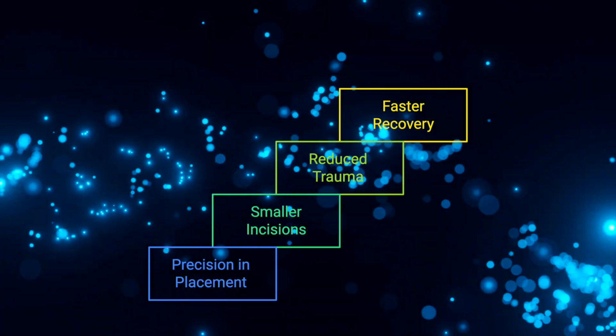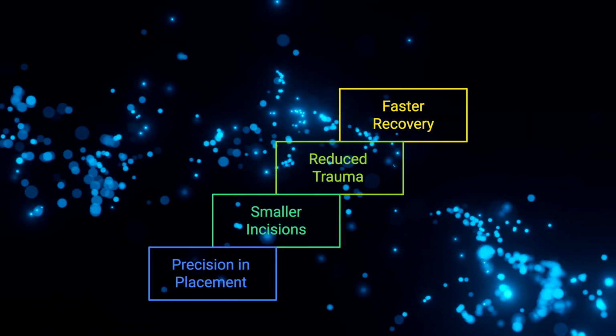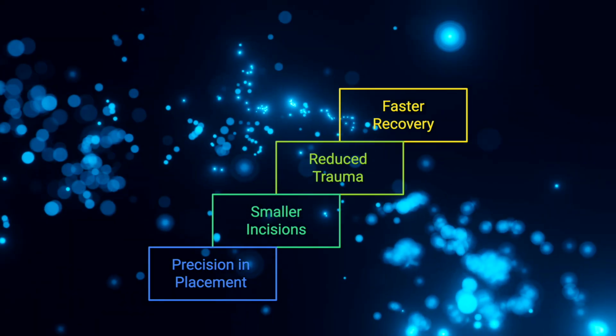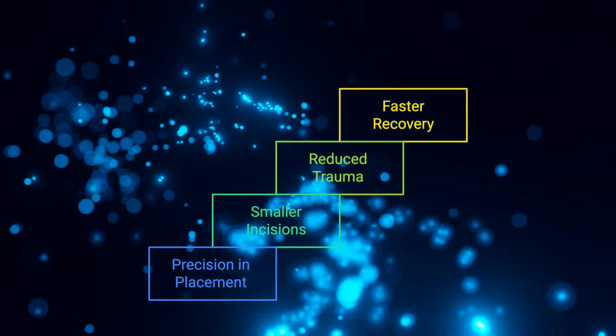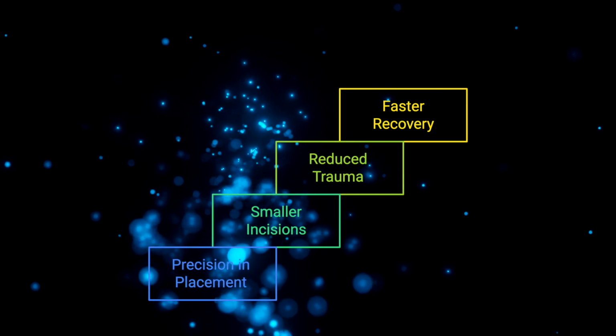This robotic-assisted approach to TLIF surgery offers numerous potential benefits, including increased precision in implant placement, smaller incisions, reduced soft tissue trauma, and potentially faster recovery times for patients.